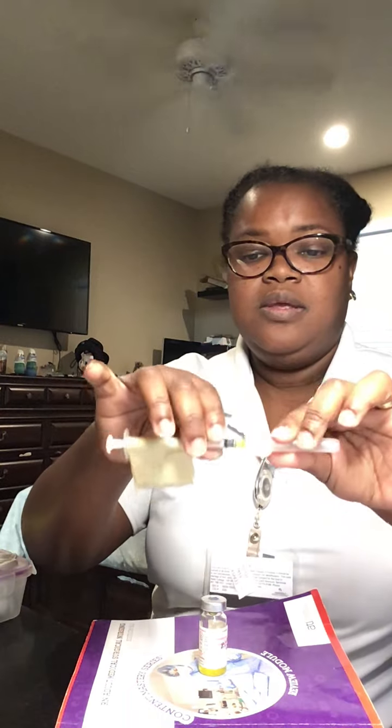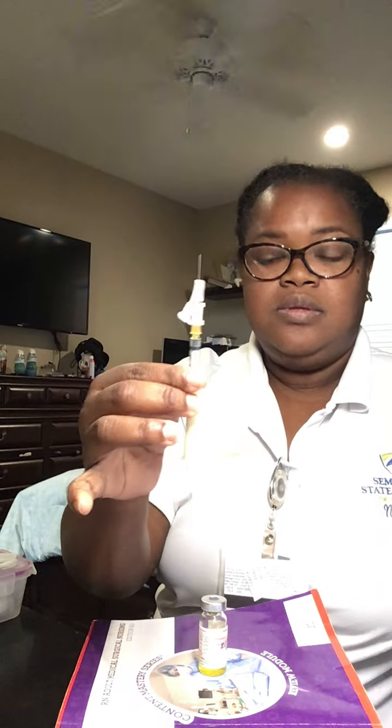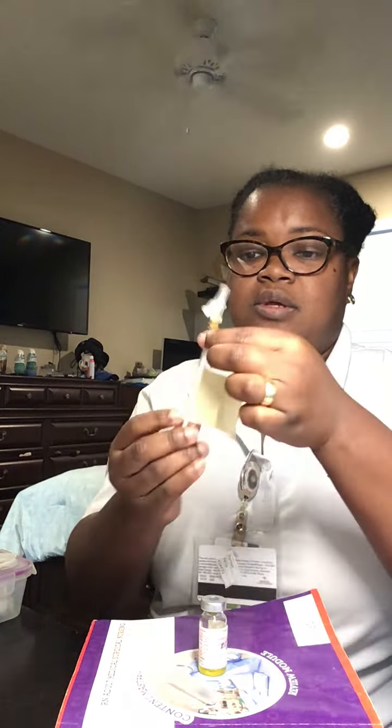Now I'm going to do the same with vitamin 12. I already cleaned the top. Butterfly motion. Okay, I'm going to put it there, cap here. I'm going to catch the air because I just need 0.5.